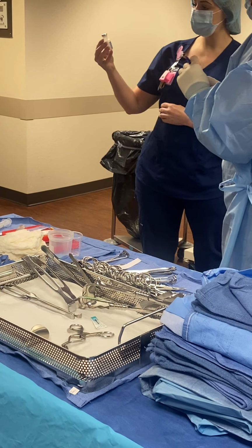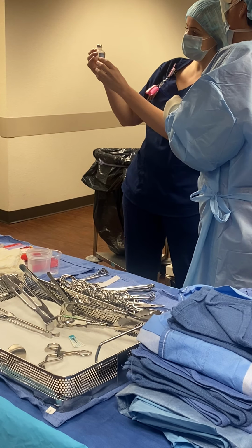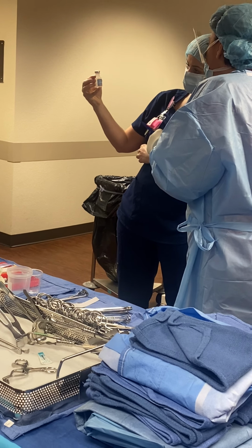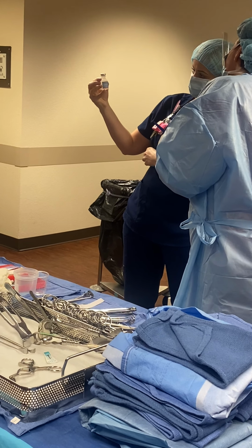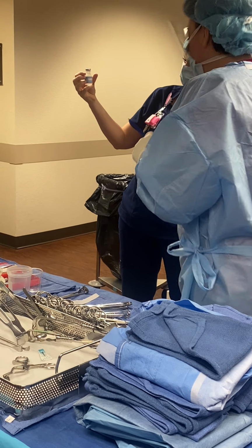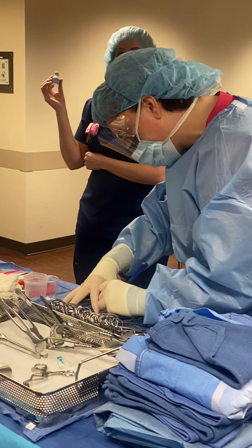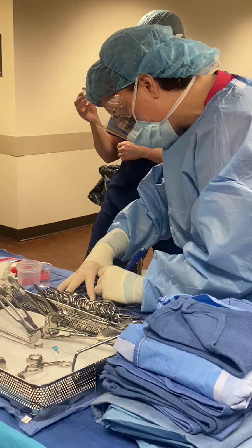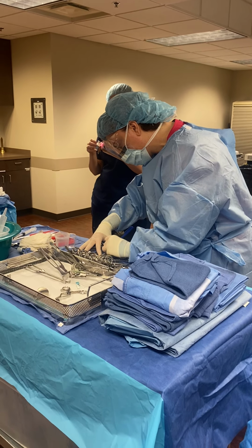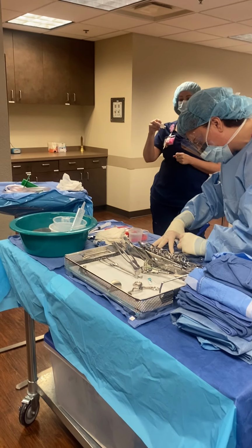Okay. All right, so I have lidocaine at 2% with epi, 1 to 100,000, 20 milliliters, and expires 8/21. Okay, I see Xylocaine, 2% with epi, 1 to 100,000, let's say, 20 mLs, 8/21. And we keep laughing because this actually says 1 to 1 million, and you'll never see 1 to 1 million. It's just a typo there. So then once the circulator pops the top off, they'll take an alcohol swab and swab the top for 10 seconds before you draw up any of your meds.